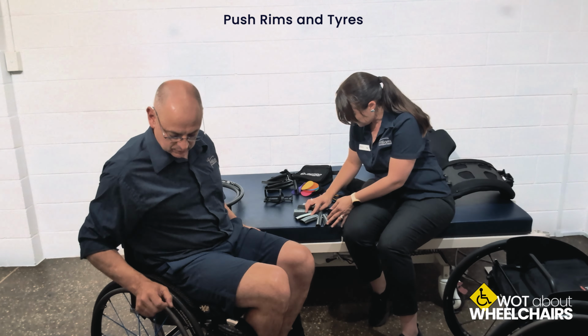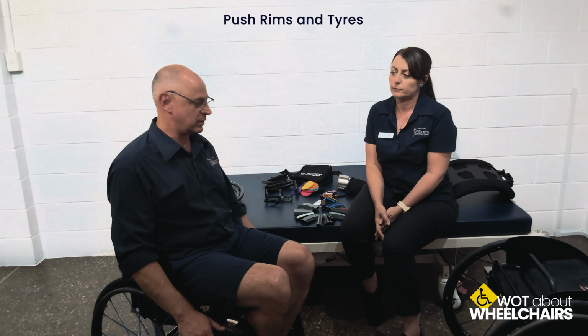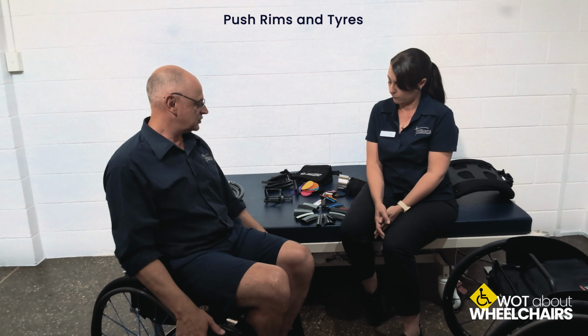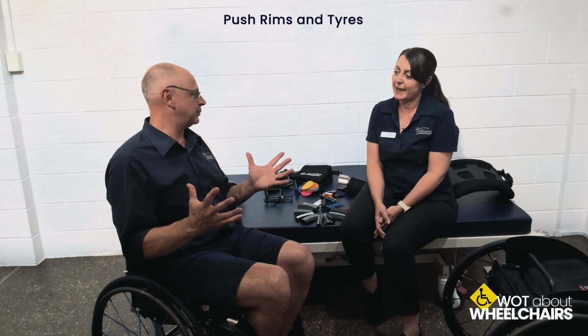I know not all wheelchairs have thin tyres like the one that I'm on now. You can get quite wide, chunky, off-road, heavy-duty mountain bike tyres, and they give you grip over gravelly, dirt, sandy surfaces. A little bit of extra cushioning as well, but grip is the main thing. So there are lots and lots of choices here.